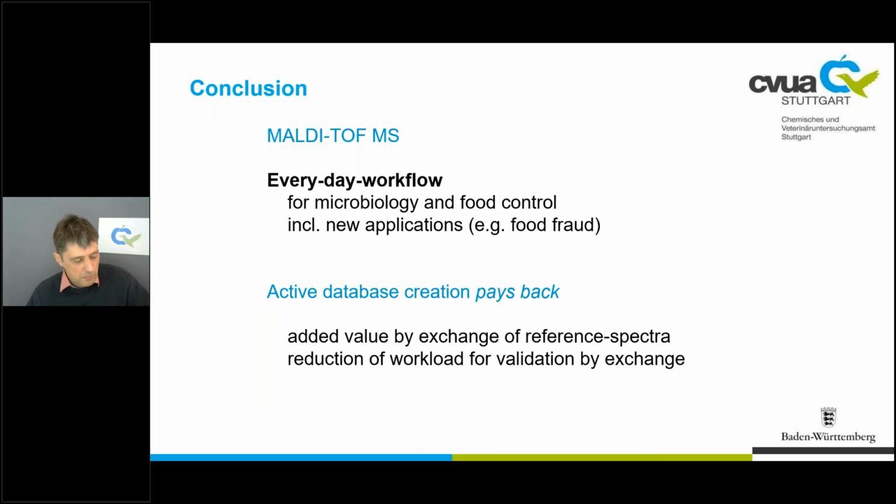So MALDI-TOF mass spectrometry is an integral part of our everyday workflow in microbiology and food control. Active database creation is successful and pays back. The active exchange helps us to reduce the workload by implementation of new parameters and in the validation process.